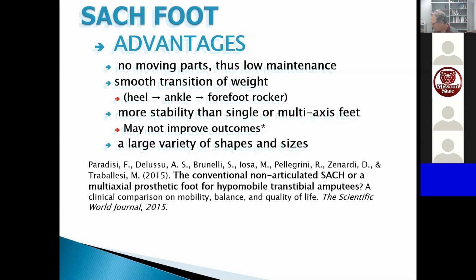Okay, and in fact, I think I have an example of this type of foot. Here we are. Okay, so can you see this? This foot here is a foot that allows for plantar flexion. It would have a glove over it that looks sort of foot-like, and I'm going to talk more about this later, but these flexible rubber bumpers in between here. So here's a plantar flexion bumper and then two dorsiflexion bumpers, but it allows for plantar flexion upon initial contact.